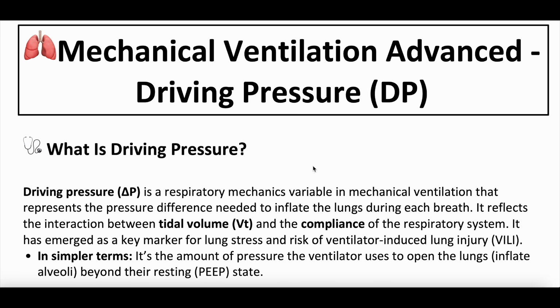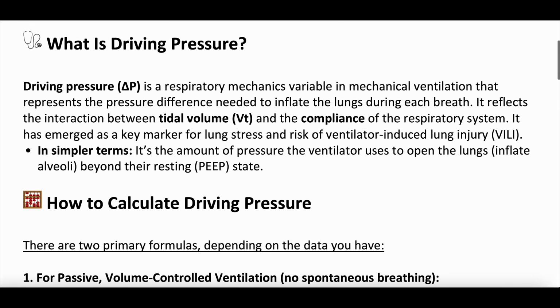Let's dive into driving pressure. What is driving pressure? Well, driving pressure is a variable that we can determine when someone's on mechanical ventilation, okay? It represents the pressure difference needed to inflate the alveoli during each breath. And we're going to come back to that as a concept. Okay, so it kind of represents this interaction between tidal volume and compliance of the respiratory system. And it's really emerged as a marker for lung stress and possible risk for ventilator-induced lung injury.